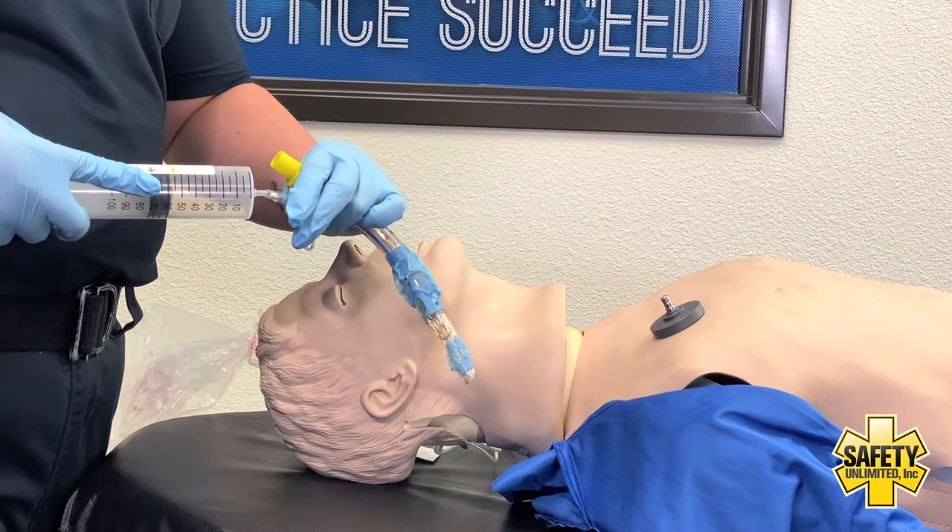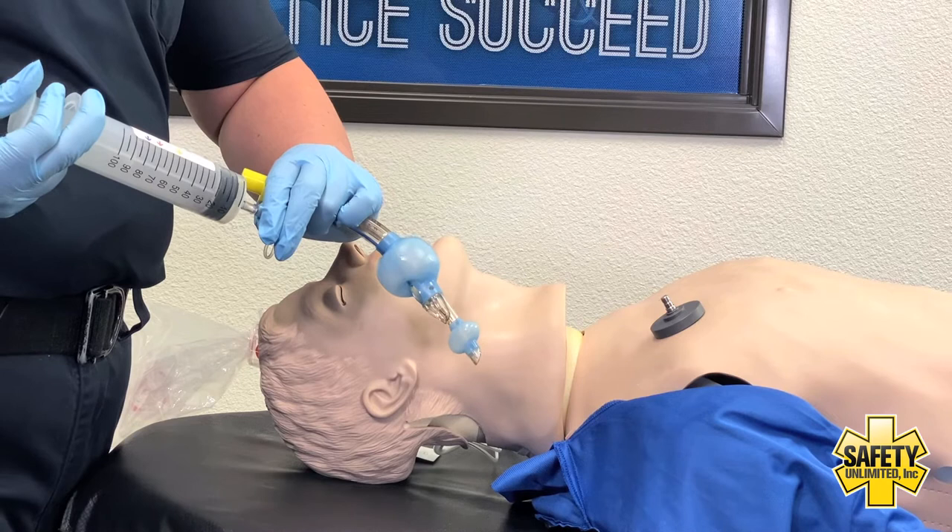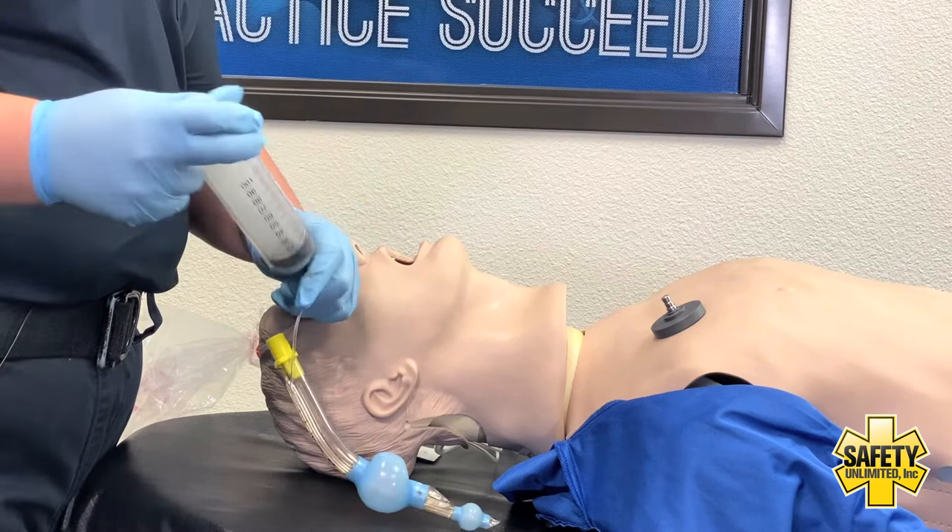I'm then going to want to test to make sure I have no leaks in my cuff. Equipment looks good, then I'm going to take the air out.